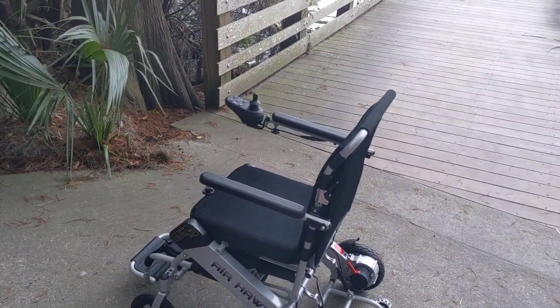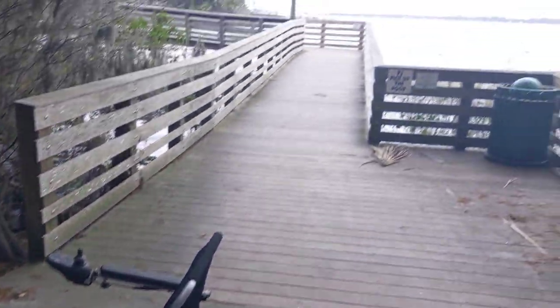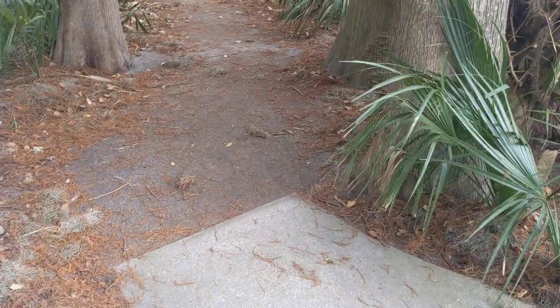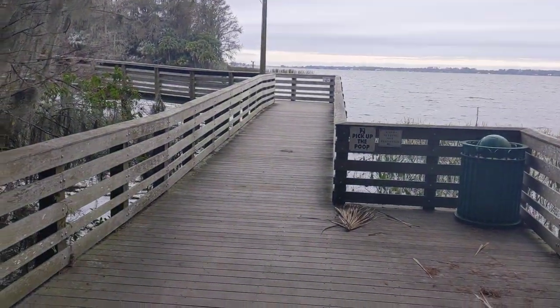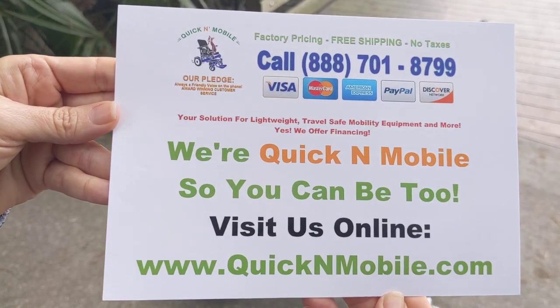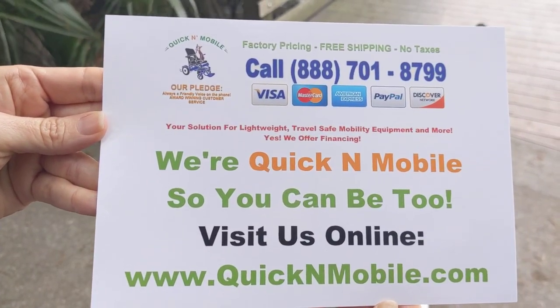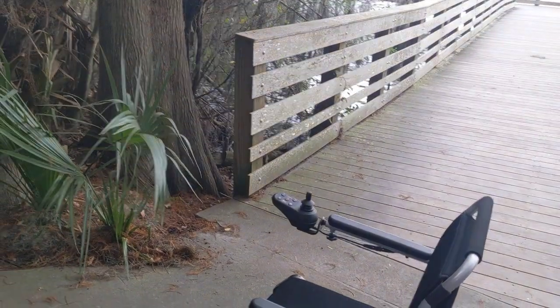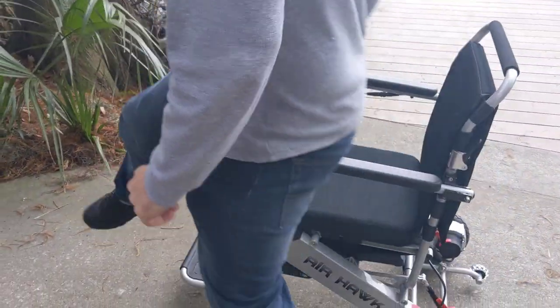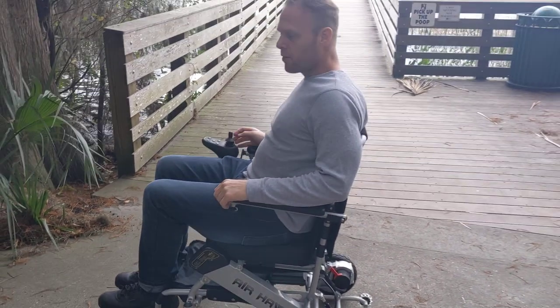Hello, this is Paul from QuickNMobile.com, and today we are going to take the Airhawk power folding wheelchair on a trail in beautiful Mount Dora. This is where you can find us online — great opportunity to pause the video. It's a little bit windy; it's a winter Florida day, but it's a great day to be outside.